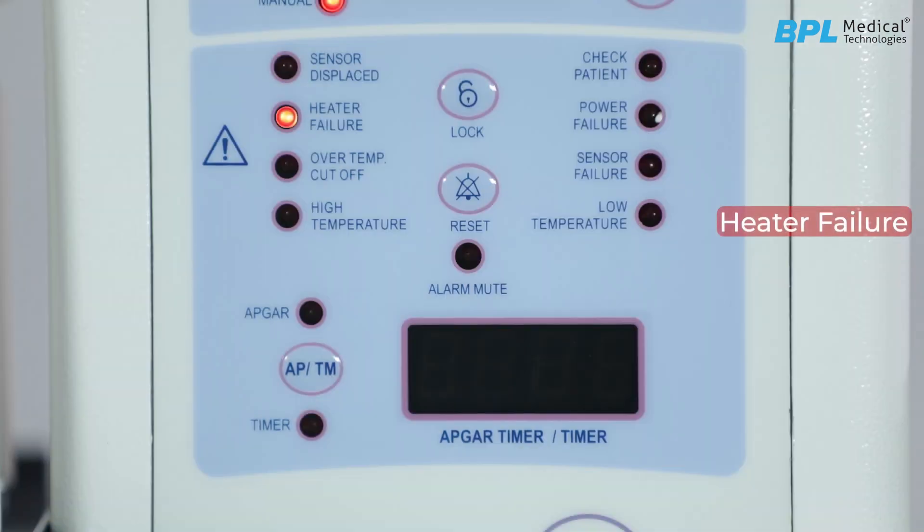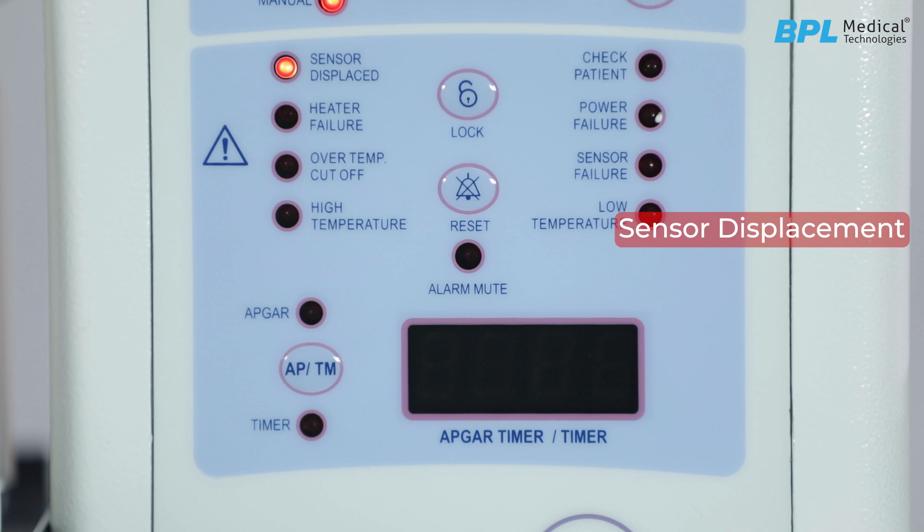Heater failure alarm is created if there is any malfunctioning in the heater head. Sensor displacement alarm: the Fluorate 1000 series detects sensor displacement from the baby's body along with a high priority alarm. The machine heater power will reduce to 50% to make sure the baby is not overheated.